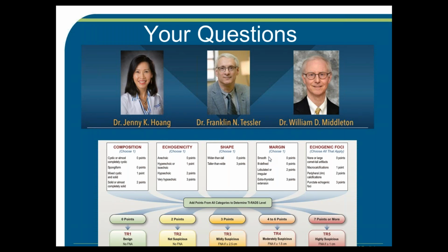Right, great. Well, we don't have any other questions, but I will say, Franklin, I really enjoyed that slide where you said we're looking at the probability of malignancy and also the probability of harm. That is a particularly good point to emphasize when we're not doing follow-up or biopsy for small nodules and we're choosing not to use terms like highly suspicious or moderately suspicious, so that we're not alarming patients.